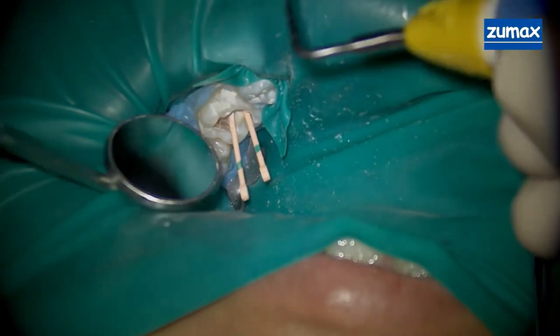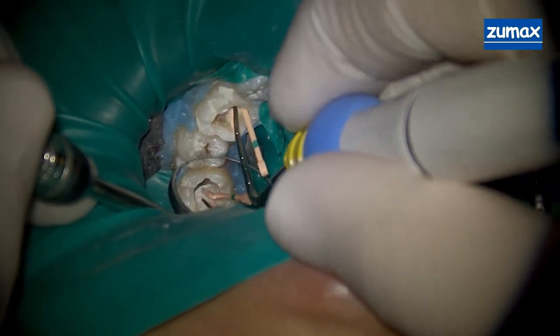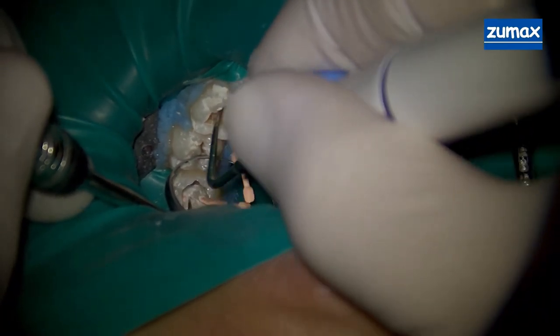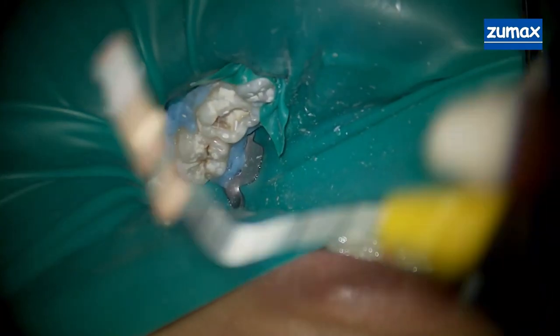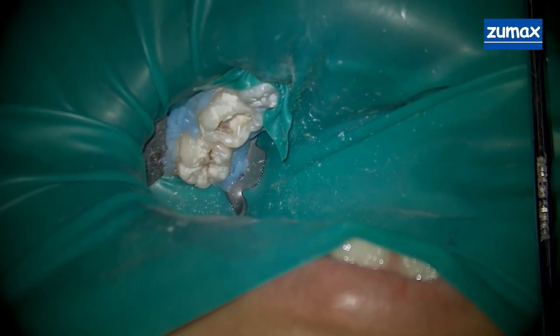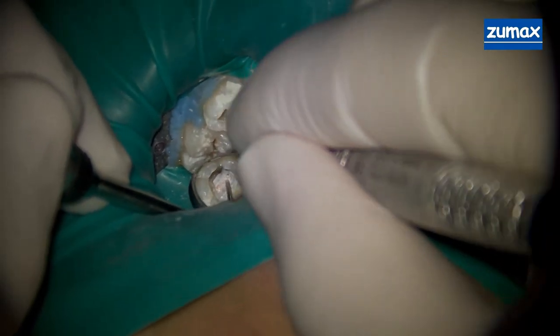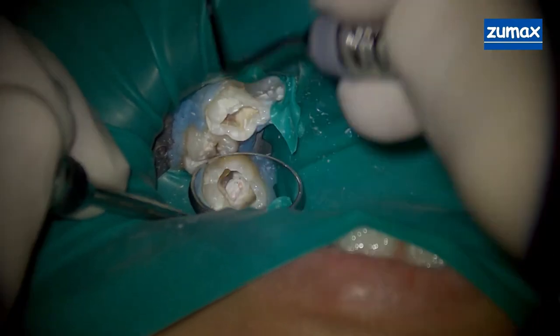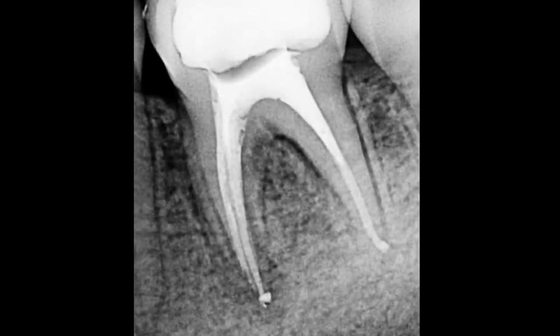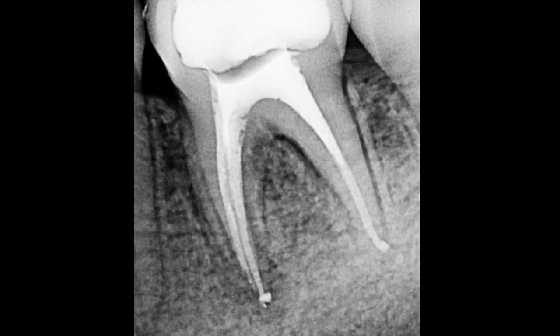At that point, we injected sealer into the canals and placed gutta percha into the canals as well. What you're seeing me do here is sear off the cones, and then we use plugger instruments to condense that gutta percha — making sure we're getting it as densely as we can. After that's done, we take a radiograph to ensure that there are no voids.